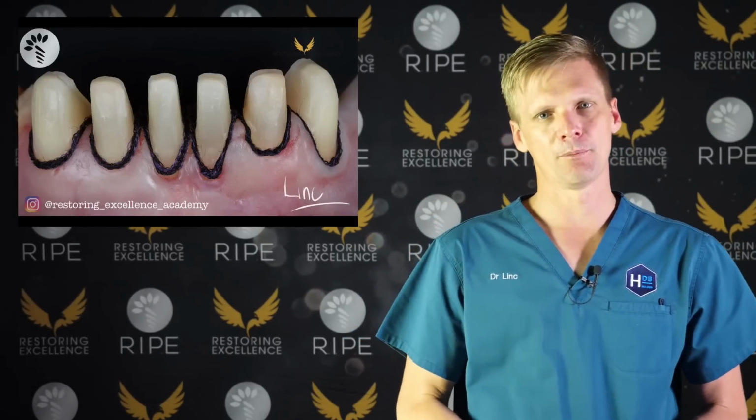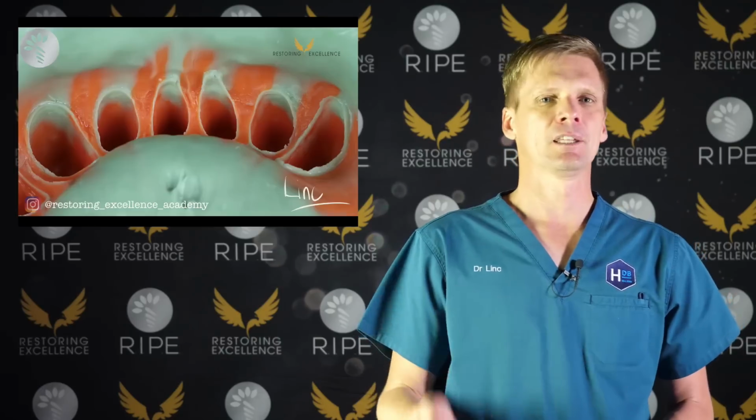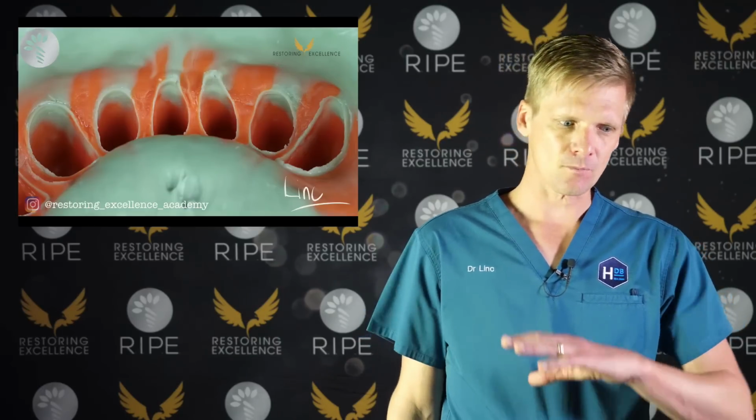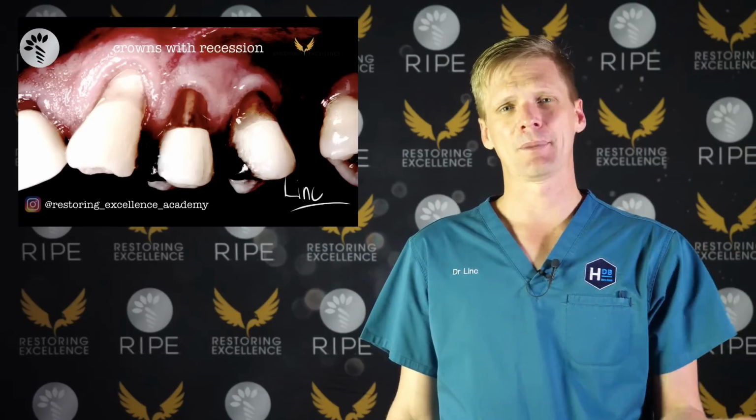And then, yes, we got the impression first go. Now, do I always get impressions first go? No, I don't. But when I do the steps correctly, I get them first go very often. What about if you have recession? Recession is tricky because you basically have no margin.